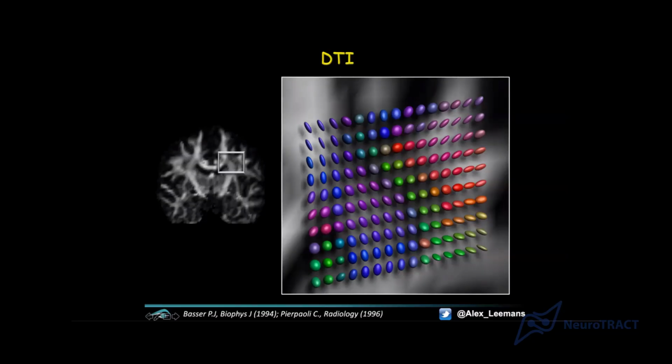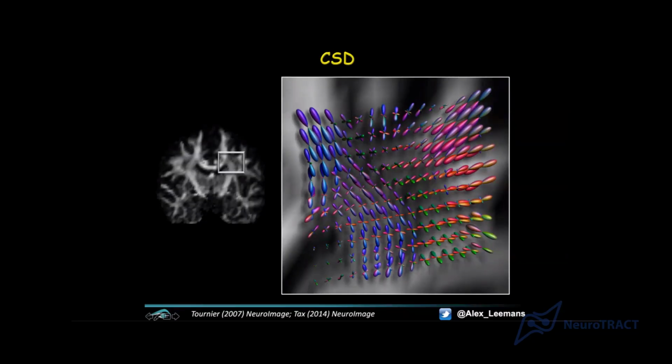These projection pathways. If you look at CSD, you see the same peaks following that orientation, but within this region of the centrum semiovale, you can also see peaks oriented left-right, meaning red. They're going more lateral. And these are parts of the corpus callosum, for instance, that genuinely cross the corticospinal pathway.